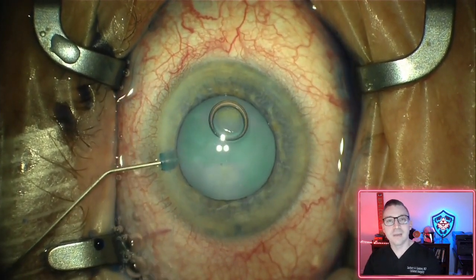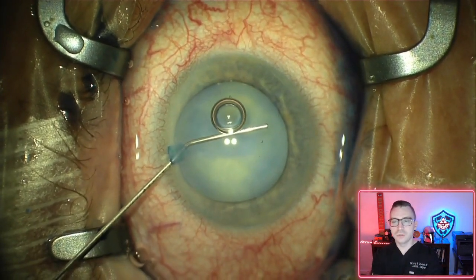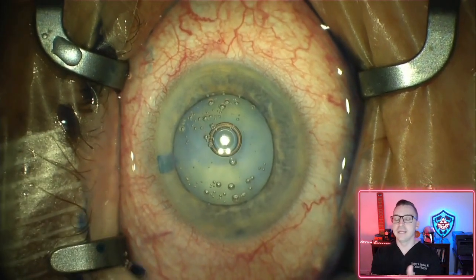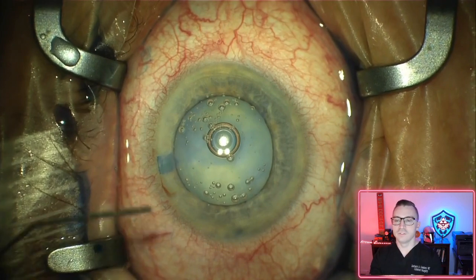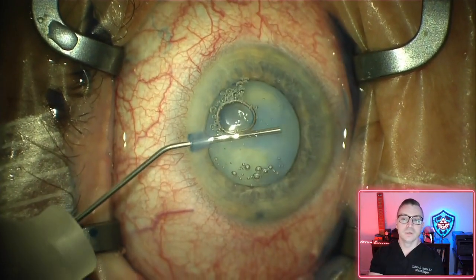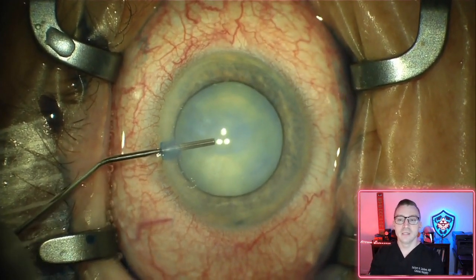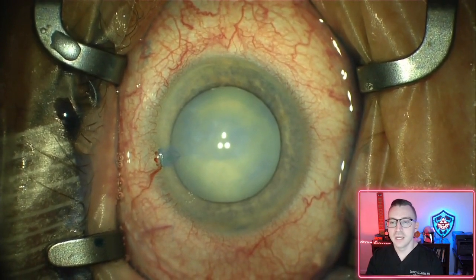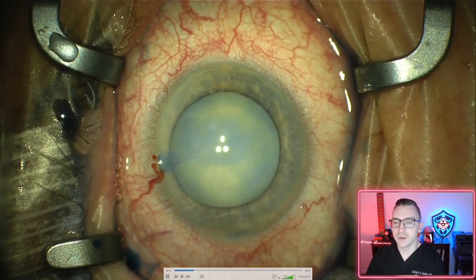Now what is the capsule? So the capsule is this thin little membrane of tissue that surrounds the cataract. It's extremely thin, especially on the back, as thin as 4 to 5 micrometers or microns. So extraordinarily thin. Anyway, you have to open up that capsule on the top part of it, open it up in a nice circle to gain access to the cataract. Well, if you don't have light coming through the cataract, you can't really see what you're doing. And so I put some dye on there to help me visualize that. And we'll see that here in just a moment.